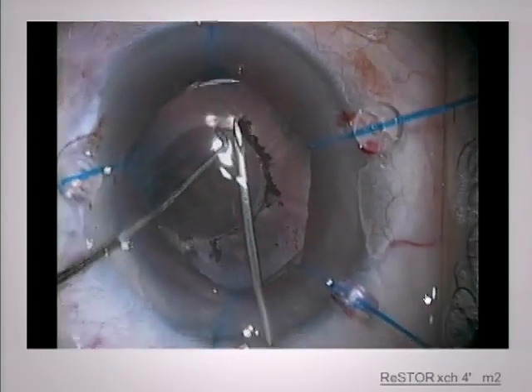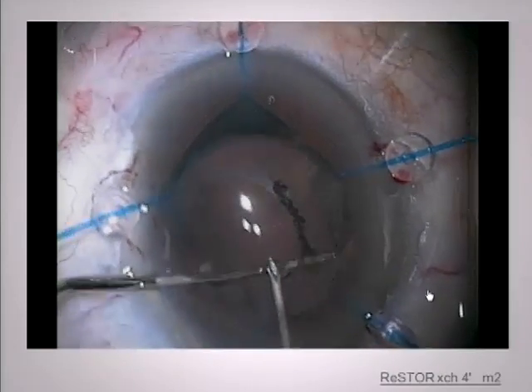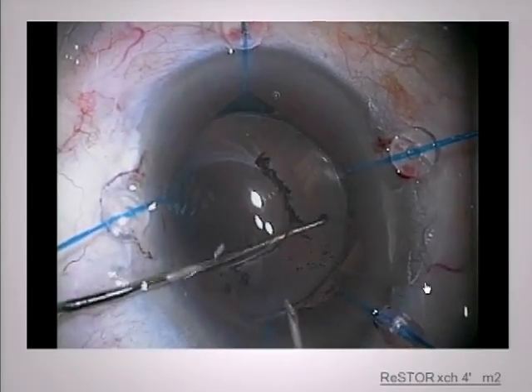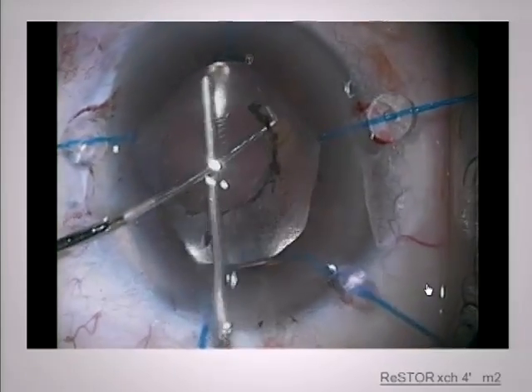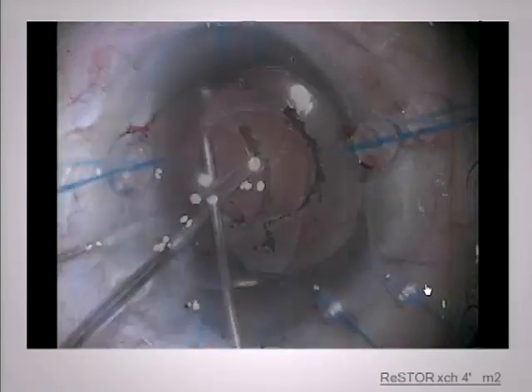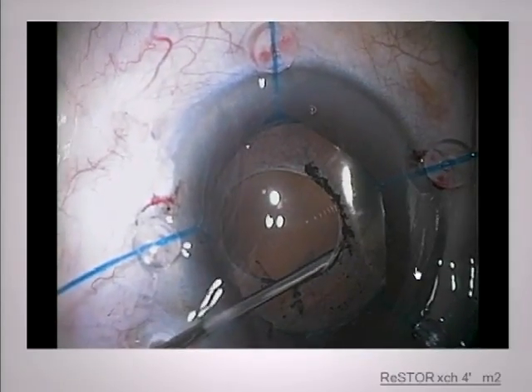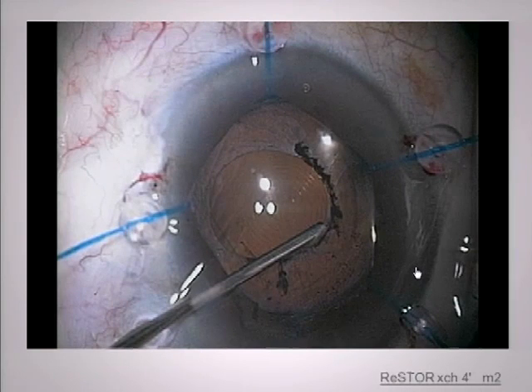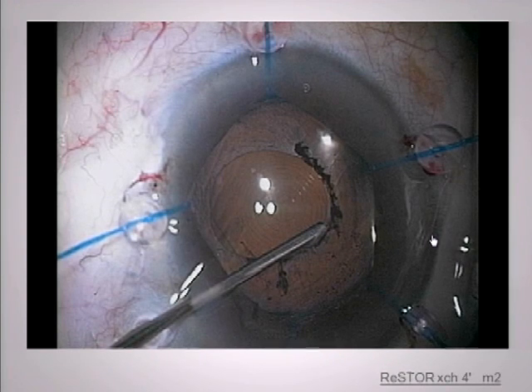You get this tightly bound sphincter-like effect of the rexis to the IOL, and you really have to go around in several directions to break that. I'm literally tenting it up just so I can get my viscote cannula underneath. What viscoelastic do you like for an IOL exchange? I like to use a dispersive — it just diffuses out and stays there. I like the separation that I get from dispersives.